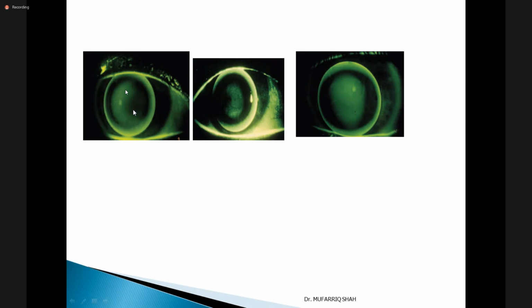So what was the first? Once the lens gets centered, immediately after the move, then you will observe. The lens is a bit towards the side, the patient is looking towards the side, so that is why on the nasal side you see a little bit of edge lift. Otherwise it is okay, because this is just 0.8 millimeter.